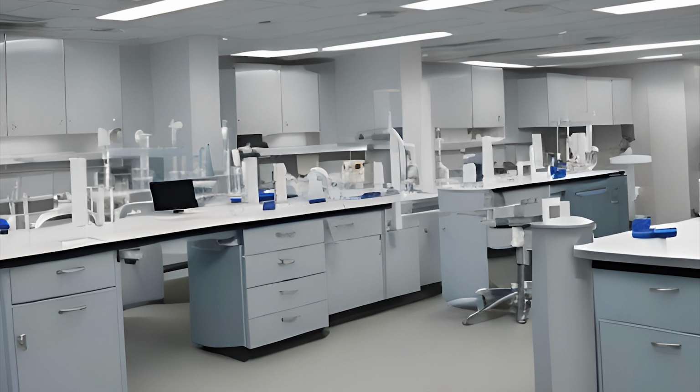Mislabeling the tube with the wrong label, mixing your tubes too vigorously. If you shake the heck out of that tube, you can cause the blood cells to rupture inside the tube, and it will hemolyze the sample. Prolonged tourniquet application, anything more than 60 seconds, runs the risk of causing something called hemoconcentration.